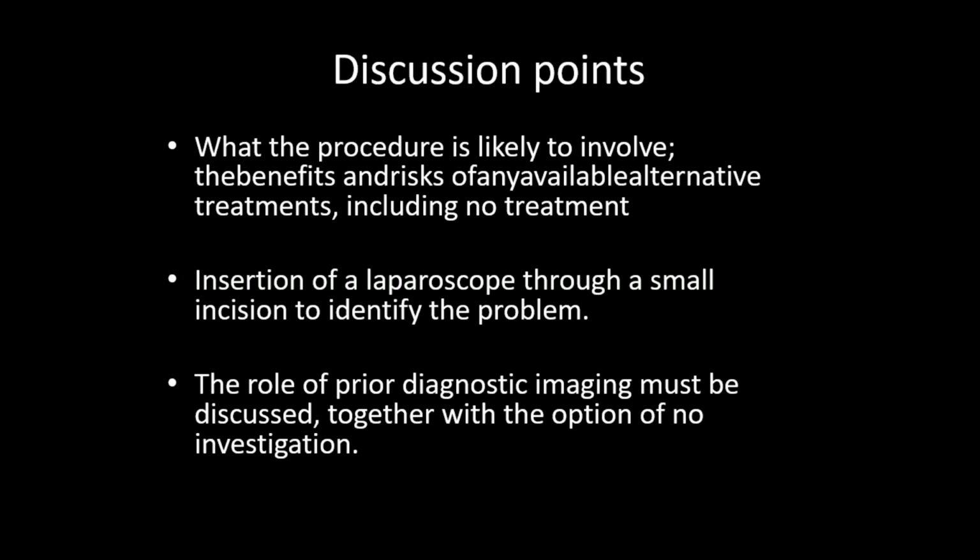Sometimes, reflexively, when I'm trying to get into the intraperitoneal cavity and during insertion of the trocar I make a major injury to the bowel, by reflex I will withdraw the trocar. Am I right? Anybody before?